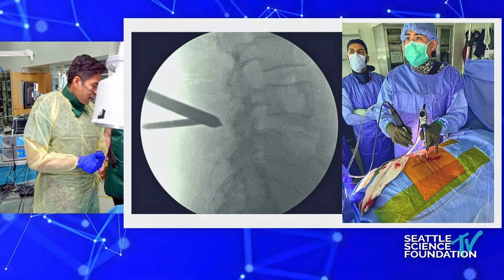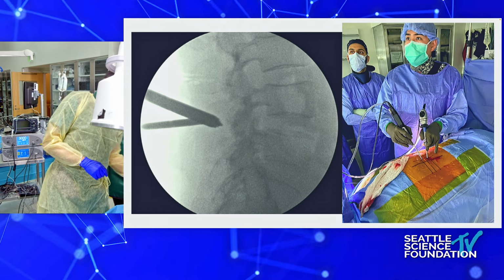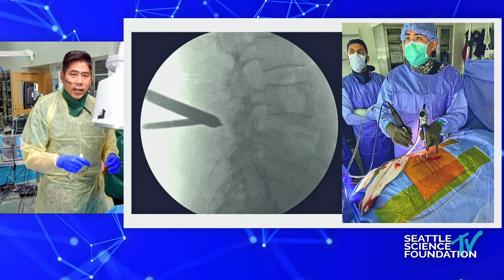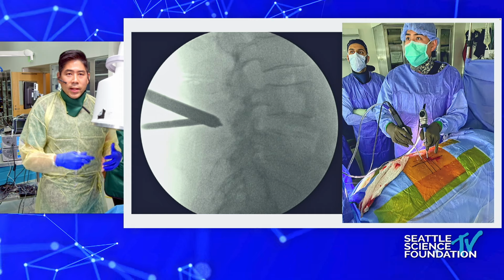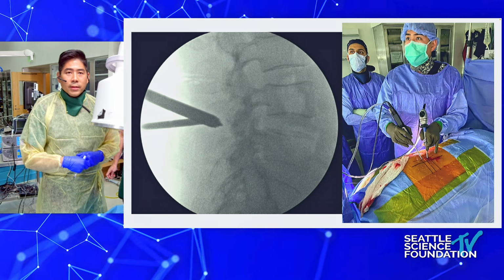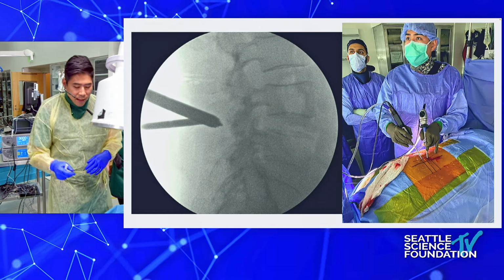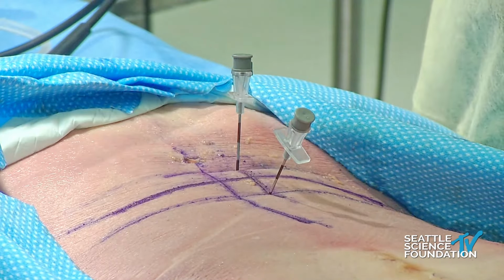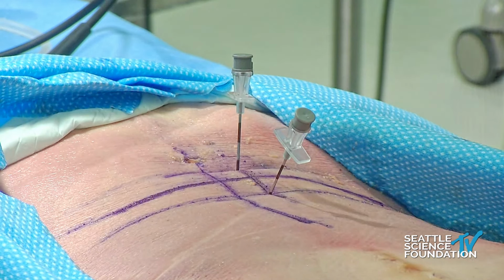After this, maybe why don't we do that? I make an incision and put the dilator, put the scope in, and I start to visualize. Let's go to the next slide. That's the last slide. Okay, so maybe we can show. Should we do the introduction of the dilation? Do you want to save that for the soft tissue part, or is that still considered your targeting? Okay, that sounds good. Thank you. Awesome. Okay, perfect.